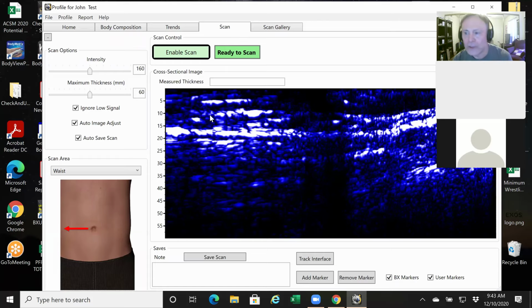So if all I wanted to do, for example, and I'm going to get back to that case with the assessor and his athlete, but if I just wanted to make sure I was at 17.3, same thought process. I'd start from the top. I'm looking for the first heavy band of signal beyond 10. And hopefully you'll both agree with me. It's right here. It's a very consistent band of signal as opposed to a dot or intermittent signal. Visually speaking, if we just look at the scale at a quick glance, we see this band is right around 17. You can see that there's a thickness to this band of signal.